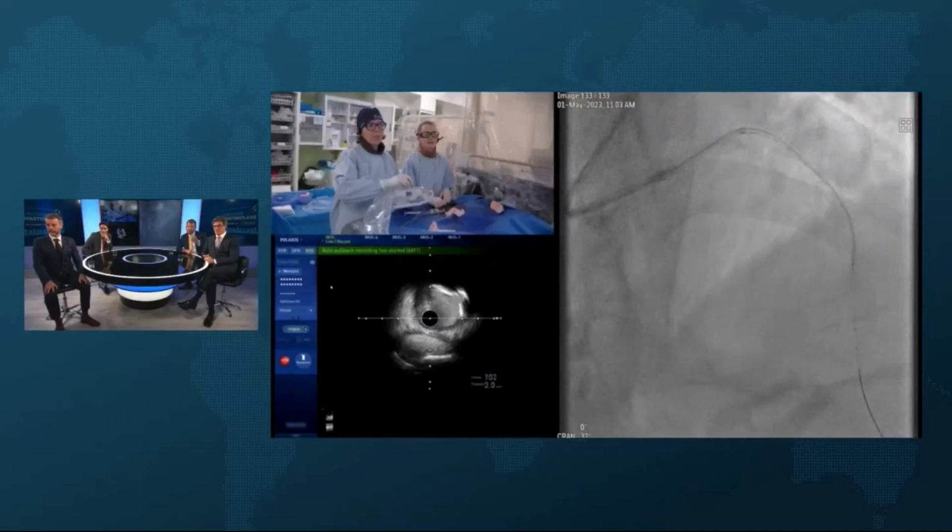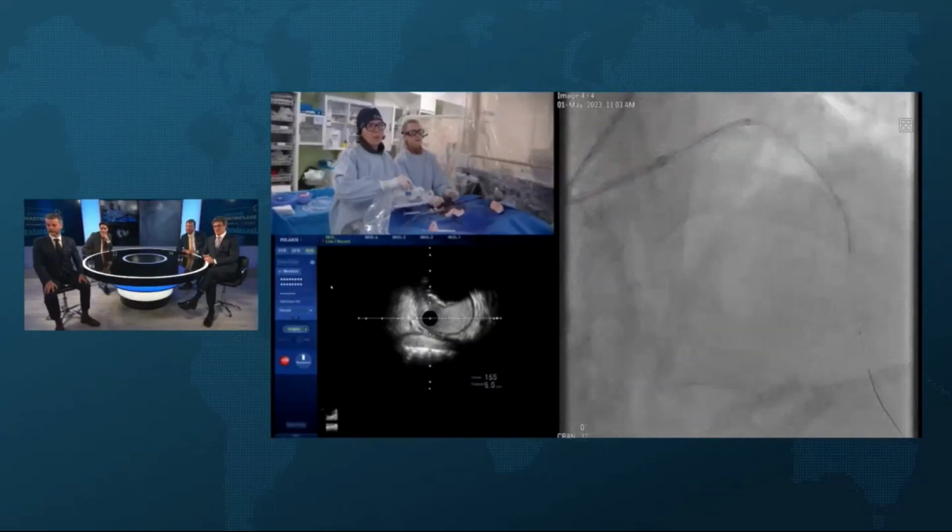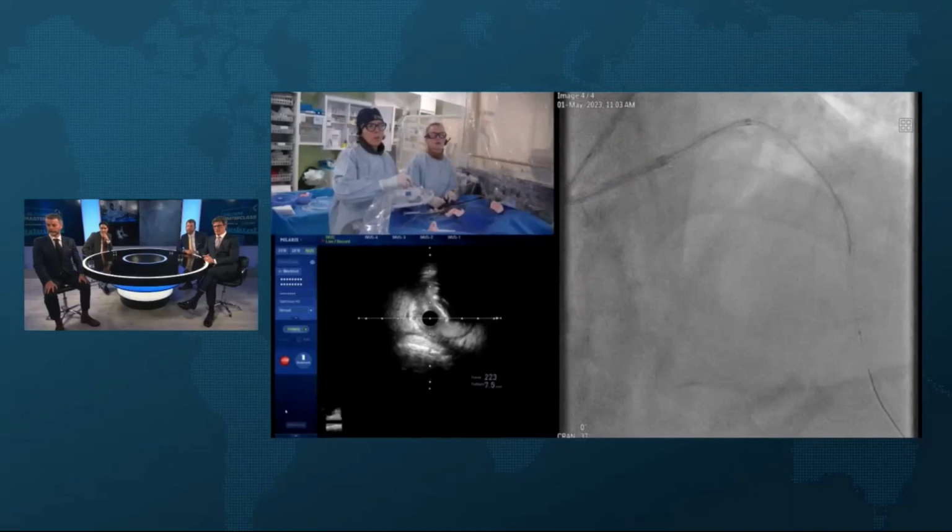So that's a good landing zone there. We'll take that. Look at that though. That'll push though. It's certainly a well-chosen case for nodular calcium.